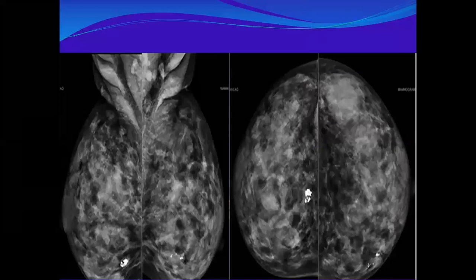What about this? This is from the literature. It's not my case. Abir? Who's talking? Hannah. Hala. Yeah. This dense breast first. Excellent, yes. Dense breast. There is an area of central asymmetry.